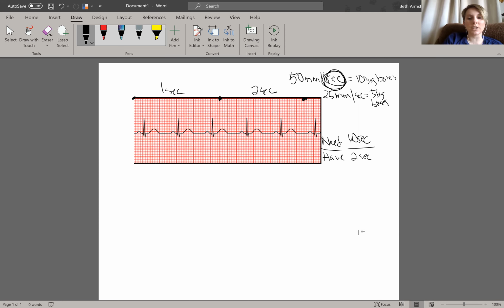So Michelle, you got 30. So it's, yes. So on here, we did 60 seconds divided by 2. You're right. It is 30. So you're correct. Okay, so when we do this, we have 10 big boxes are going to equal 1 second. Does that make sense?